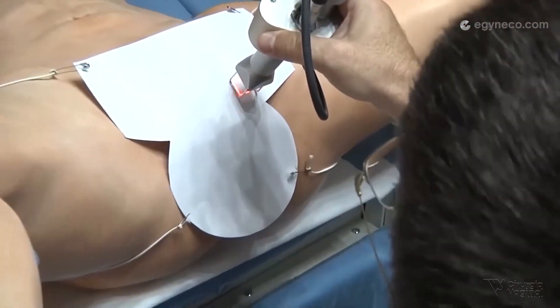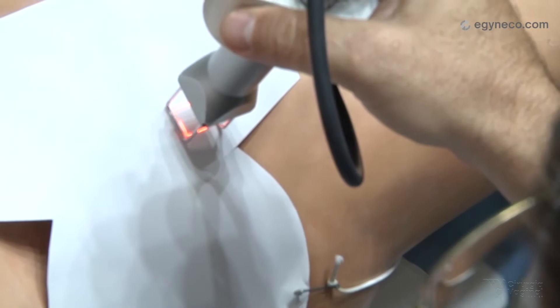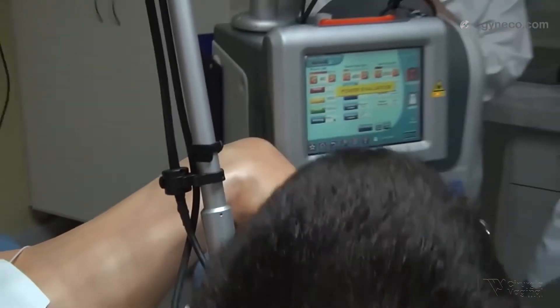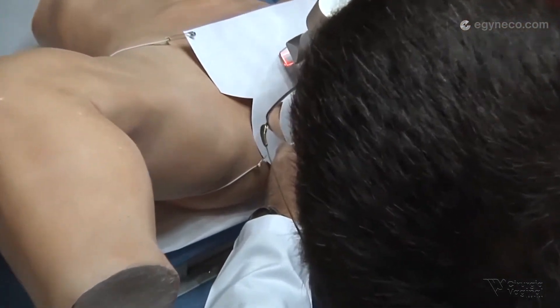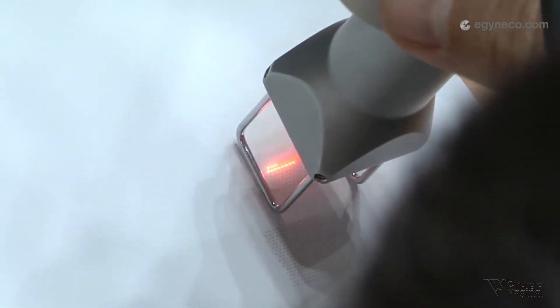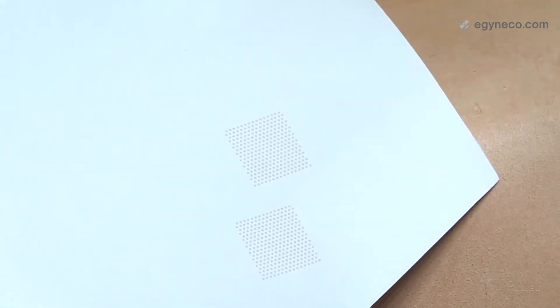With these parameters, this is the image that we have on the paper. Now notice what happens when we increase the power from 24 watts to 40 watts — it marks the paper deeper.